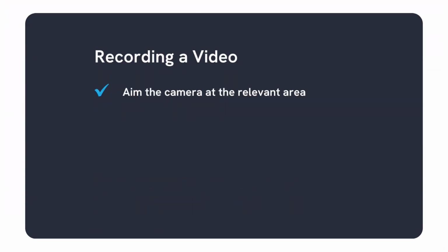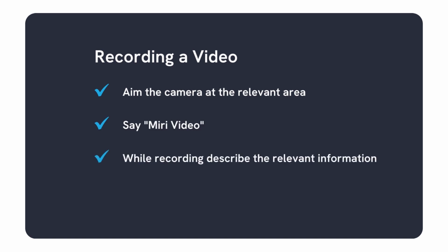In order to record a video, aim the camera at the relevant area and say MIRI video, and then describe information relevant to the course of the treatment, including treatment details, dosage of substances, clarifications, and agreements of the parties. Once you're finished, say thank you.